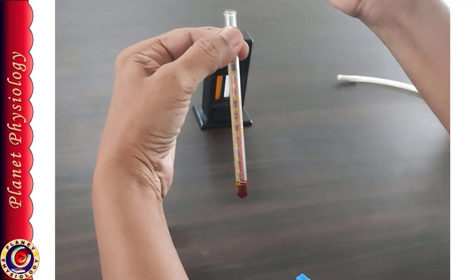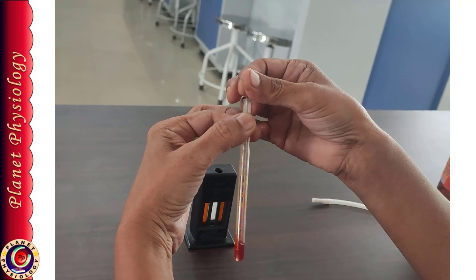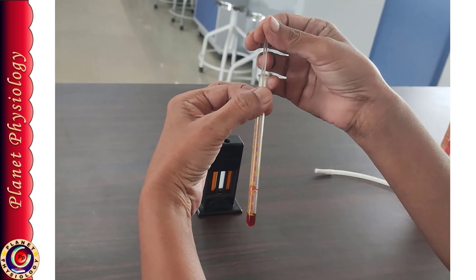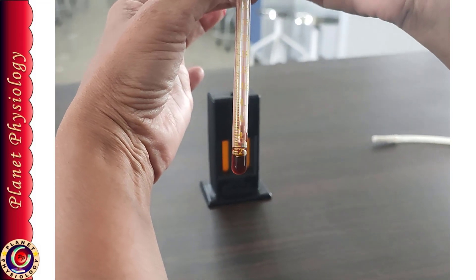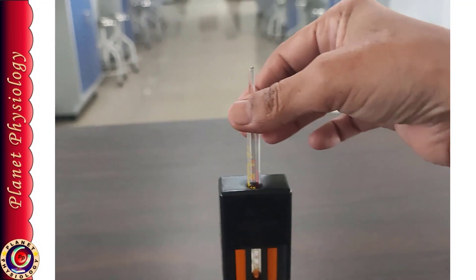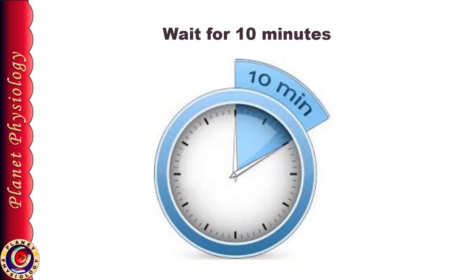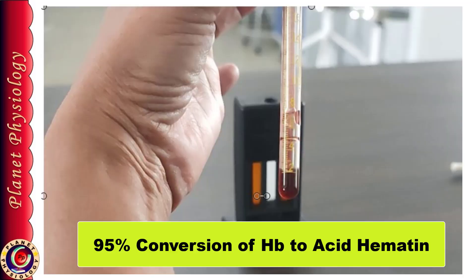Take out the pipette and insert the stirrer into the tube with its flat end inside. Mix the contents by rotatory action of the stirrer. Once the stirrer is placed inside the tube, keep it inside throughout the experiment to prevent loss of contents. Place the tube back into the hemoglobinometer and wait for 10 minutes. During this time, the acid causes hemolysis and converts hemoglobin to acid hematin. Although the color change is immediate, the reaction takes 10 minutes to complete, during which 95% of the hemoglobin gets converted to acid hematin.